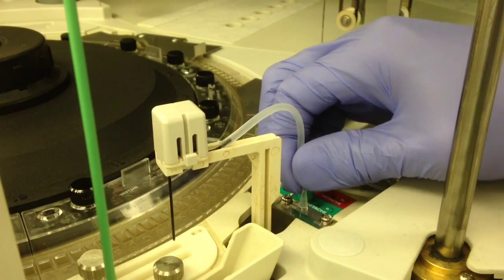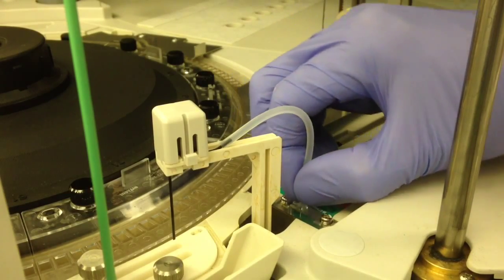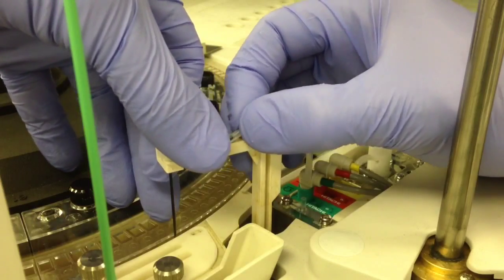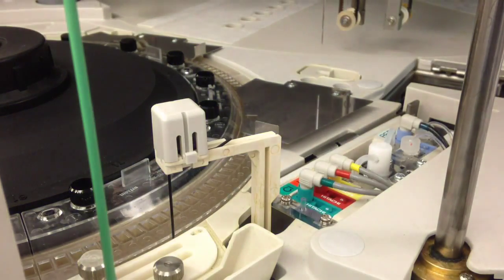We're going to be changing this tubing here on the sipper probe. Just be very careful when you're removing the tubing, especially from the actual probe itself. You don't want to bend anything.